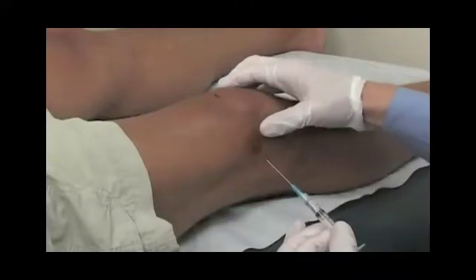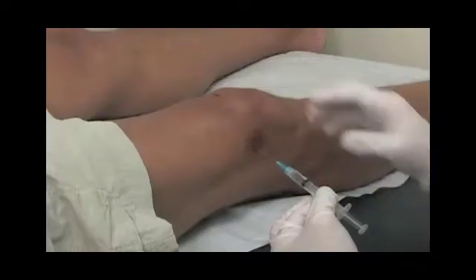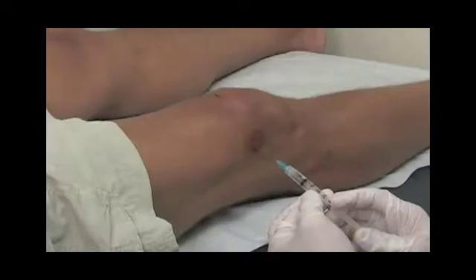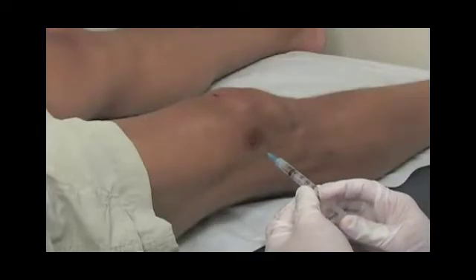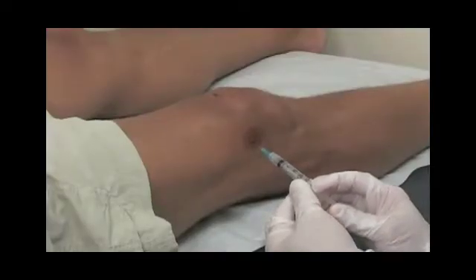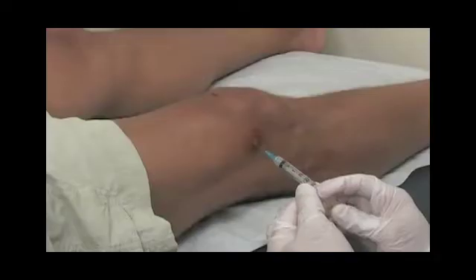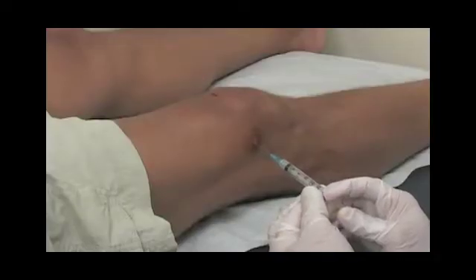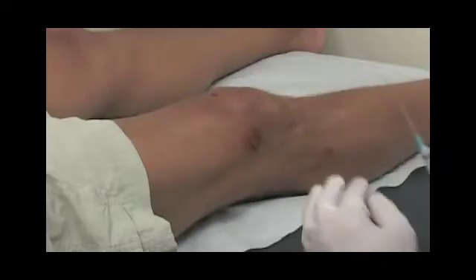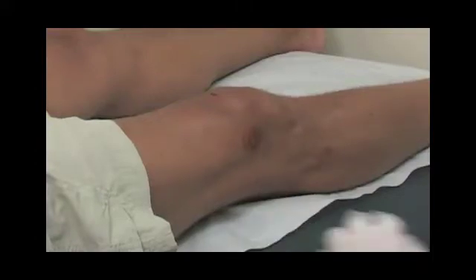We'll then place a 25 gauge needle with approximately one cc of lidocaine into the skin, into the subcuticular tissue, into the fat underlying the skin, right to the region of the capsule. At that point, we'll withdraw the needle and give the lidocaine some time to work. The lidocaine really works instantly, and we'll be going through this area with another needle right through the region we've just inundated with lidocaine.